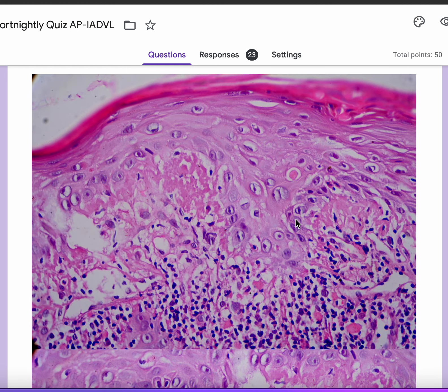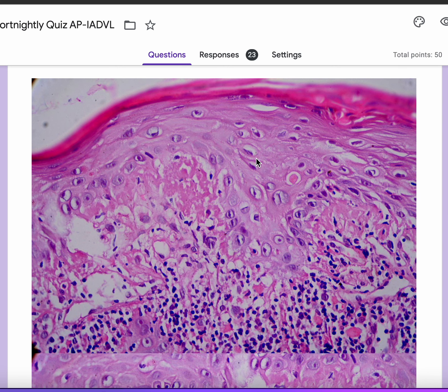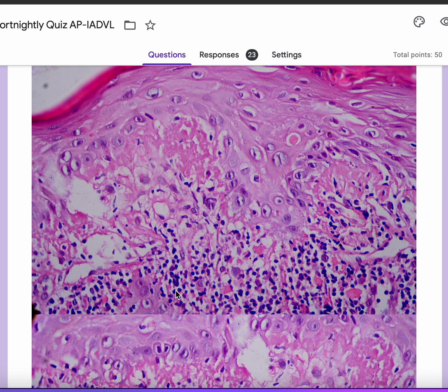What you can also make out is that the apoptosis of keratinocytes extends high up into the epidermis, and there is also some focal parakeratosis.